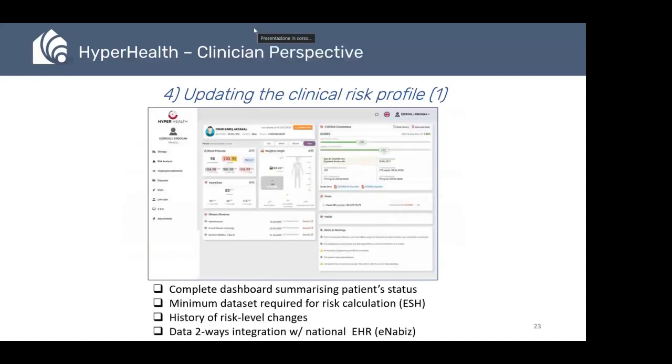Then we have the platform allowing the setting of blood pressure targets and analysis of the patients through the CDSS, which obtains the clinical data, processes it and returns therapeutic recommendations to improve the person's health condition.